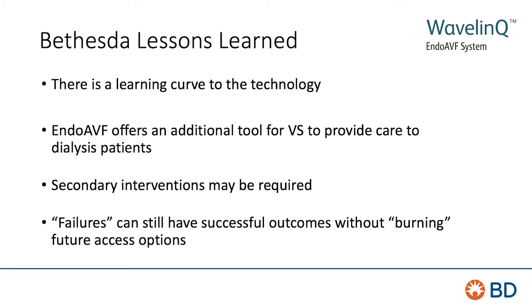I think that you have to be aware, depending on your locale, that secondary interventions may be required. Lastly, the one thing that I learned is that when I did not create a fistula in the operating room, I did not burn any of my surgical bridges.